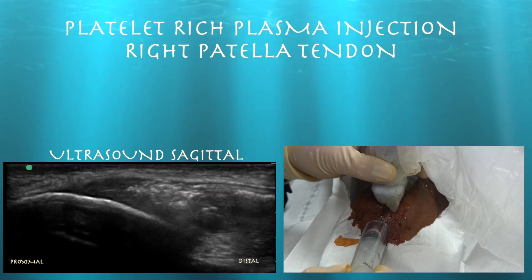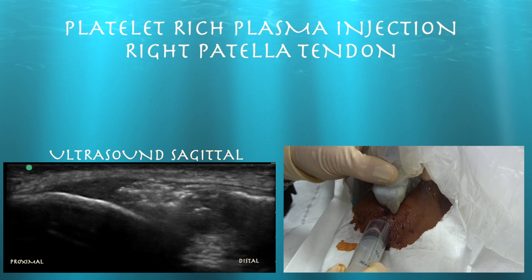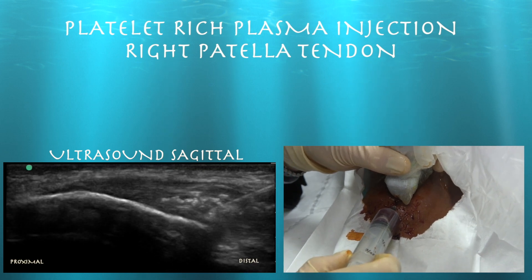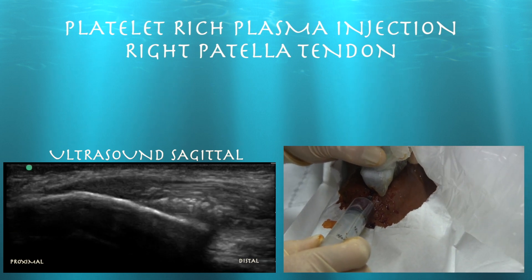Hang in there, we're getting there, we're almost done. You can see how the PRP basically fills in any kind of defects within the tendon.